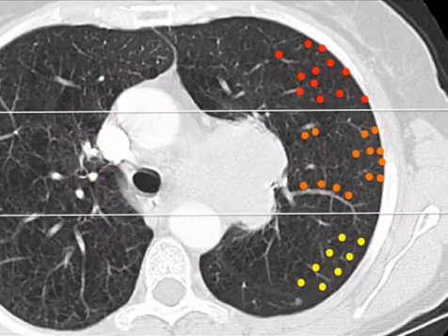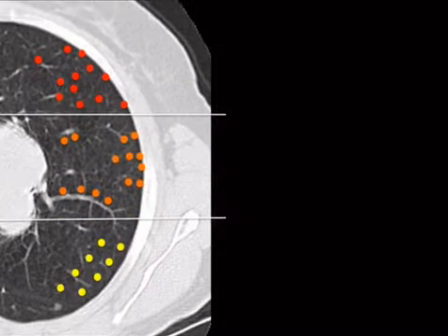So there are three basic patterns of pulmonary nodules that are described, and they have a differential. Now, as I've talked about in my books, it's difficult to write a multiple choice test question based off a differential case, but you can, and the way that you can do it is you can say stuff like, which of the following is not in the differential, which of the following would not be a random nodule, or which of the following would not be a perilymphatic nodule.